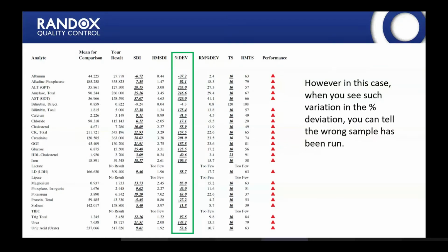In this instance, the lab can contact us to request that these results are removed, and therefore the running means won't be affected, and the end of cycle report, where we're looking at the averages of your performance indicators over the course of the cycle, wouldn't be affected. The lab can complete the relevant paperwork to show that they have submitted the results for the wrong sample. These results would be removed, and the lab would see an R appearing instead of a sample number on their future reports, and then the running means will not be affected by this poor performance.